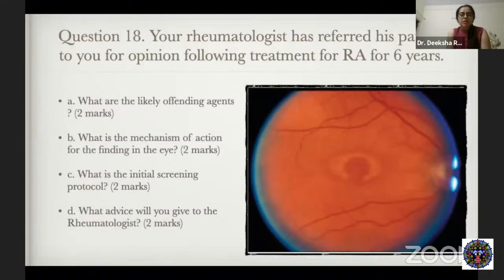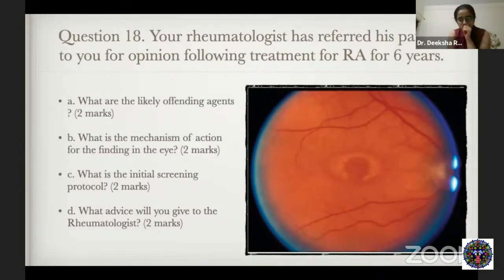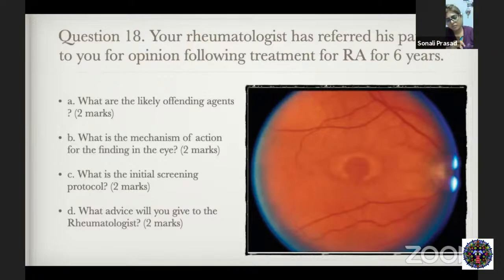Someone mentioned fields. What specific fields will you ask? I heard someone saying red and green colors. The right... multifocal ERG. Multifocal ERG. I think you work at a tertiary center probably. Okay. So vision is correct. Vision is good. I would perform a 10-2 visual field test. Look for central macular function, fundus examination, of course. You can also do the Amsler grid, the red on black one. That again tests the central macular function.